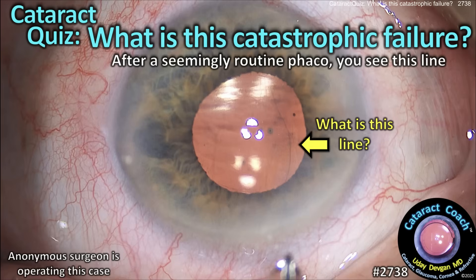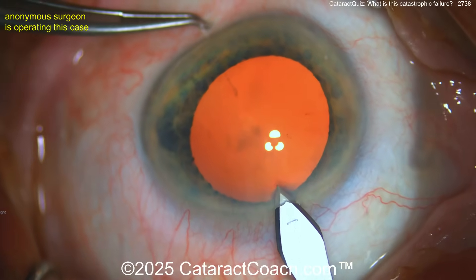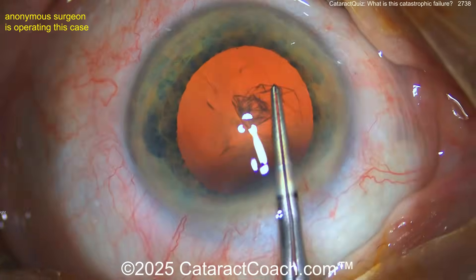CataractCoach.com cataract quiz: what is this catastrophic failure? A seemingly routine phaco, but you see that line — what is that line right there? Look carefully. Let me show you this case. I'm a surgeon; we think it's a pretty normal looking cataract case. Here's our incision, looks pretty clean. We're going to fast forward the video here.